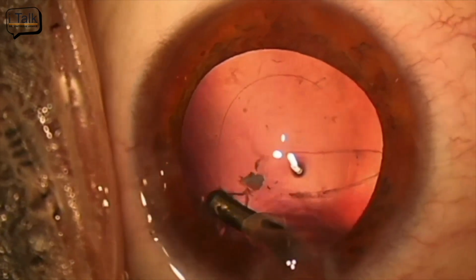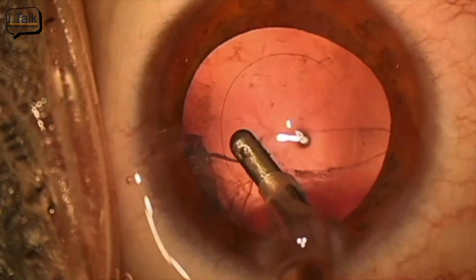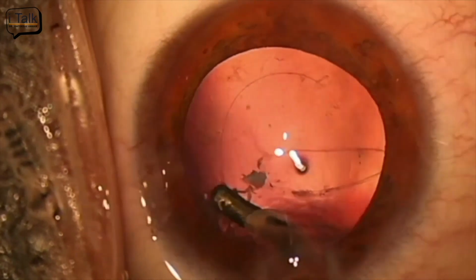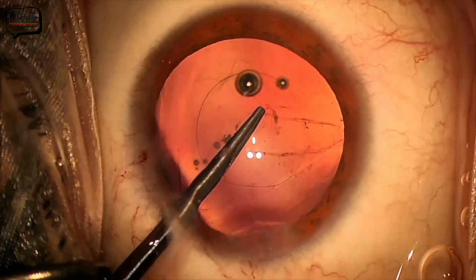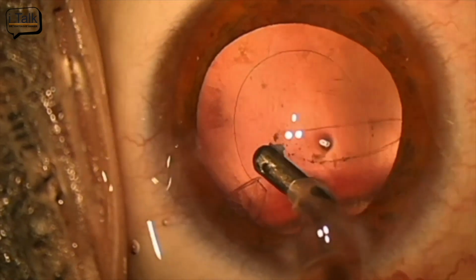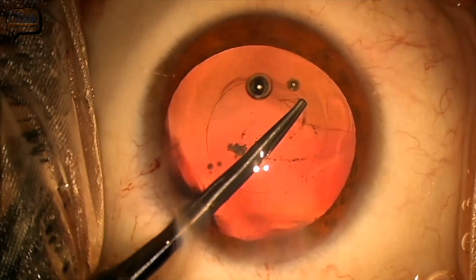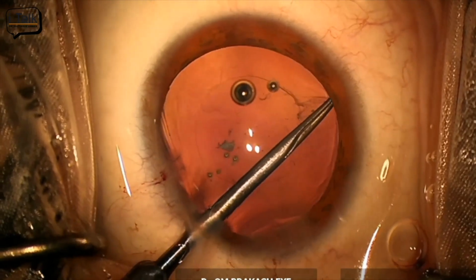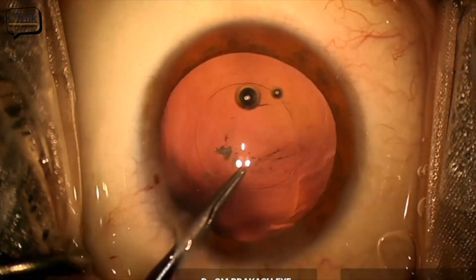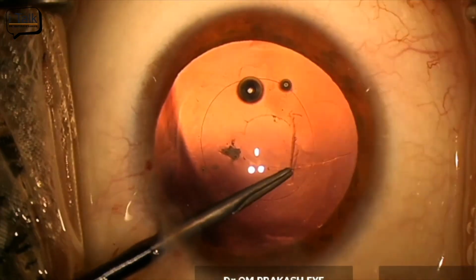the anterior hyaloid face. Now, if you see in this patient, these capsular tear edges, do you find them static or do you find that they are moving? Well, they are fluttering. The motility of the flaps shows exactly that the anterior hyaloid face is intact. So now, in this situation, you go in through the side port with stable chamber settings, and one can easily round off the rhexis margin.